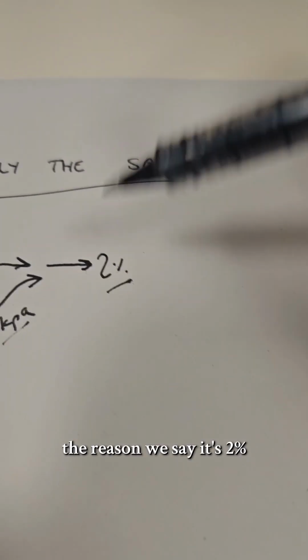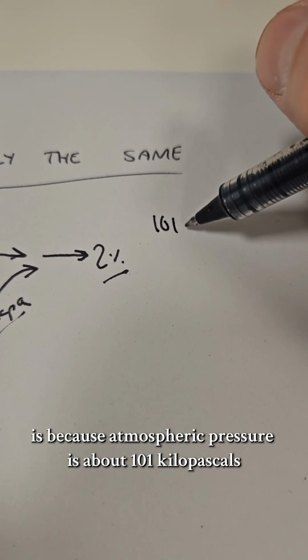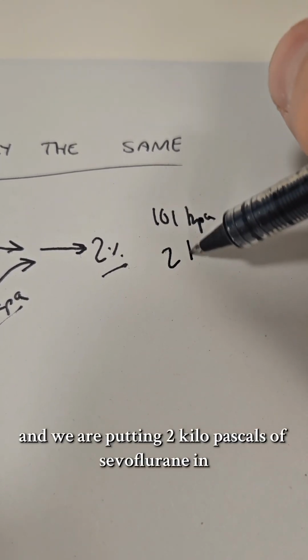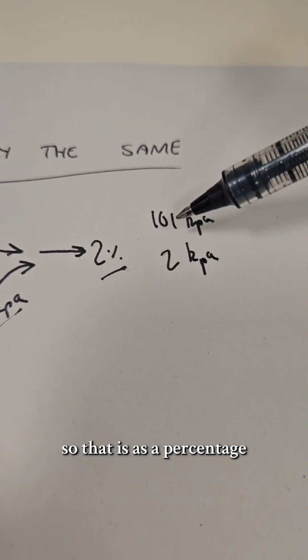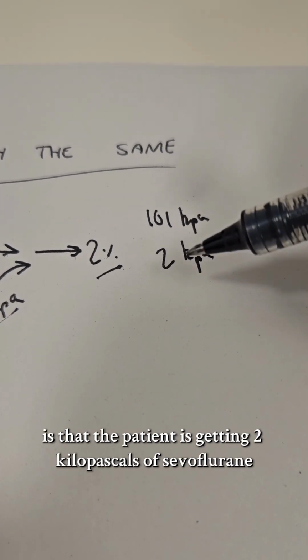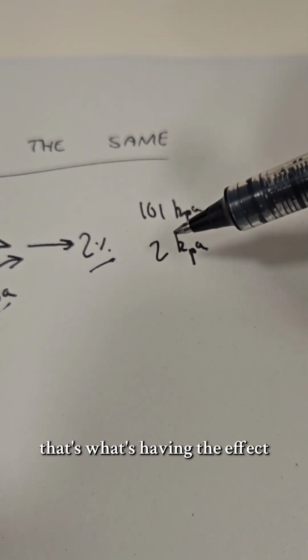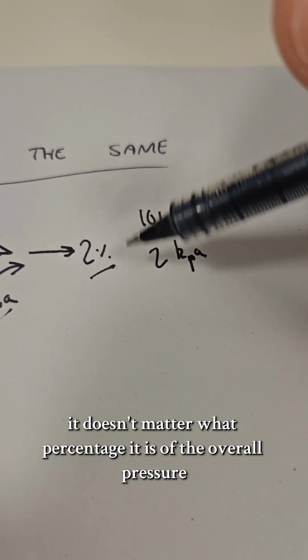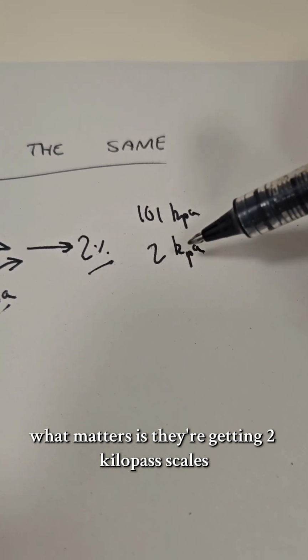The reason we say it's 2% is because atmospheric pressure is about 101 kilopascals, and we are putting 2 kilopascals of sevoflurane in. So that is, as a percentage, about 2%. But what actually matters is that the patient is getting 2 kilopascals of sevoflurane. That's what's having the effect. It doesn't matter what percentage it is of the overall pressure. What matters is they're getting 2 kilopascals.